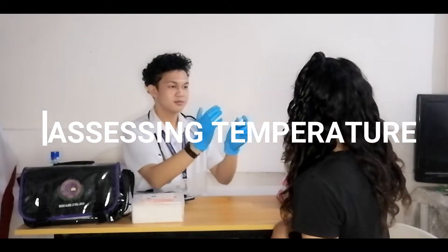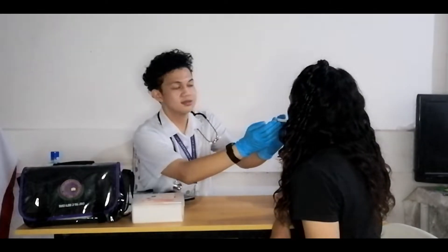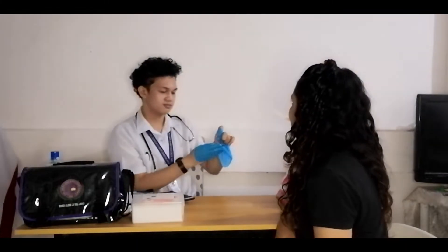Alright. Okay, Ms. Cindy, may I ask you to open your mouth. Just clip it under your tongue and we'll just wait for it. While waiting for the thermometer to go off in her mouth, properly dispose of the glove and perform hand hygiene. Alright, your temperature is 36.5.